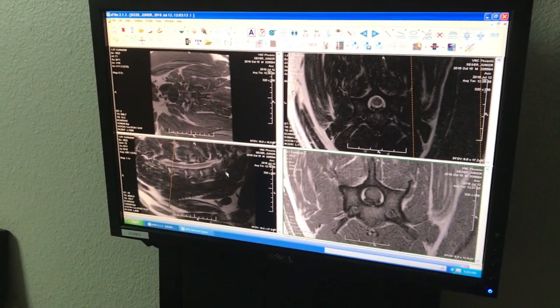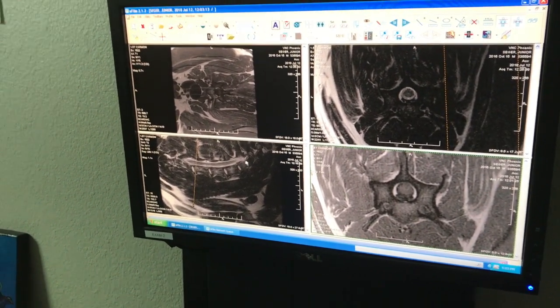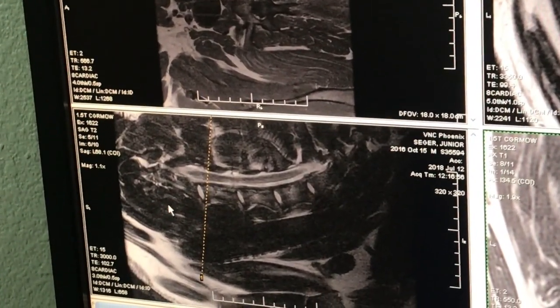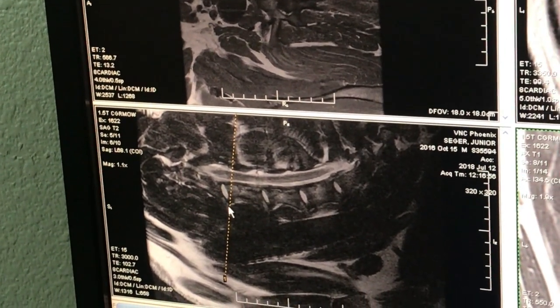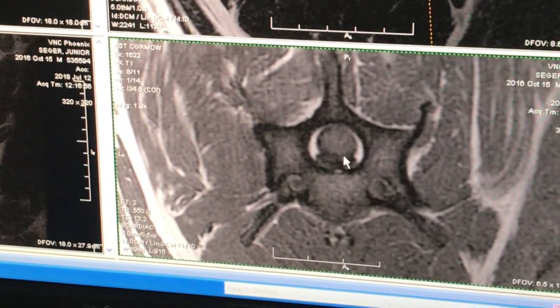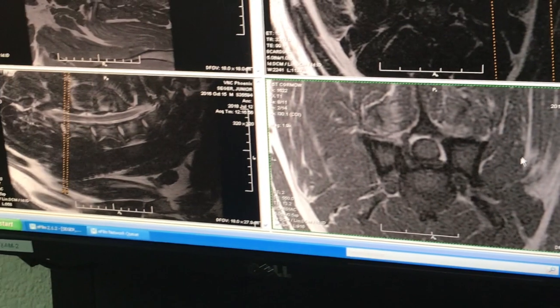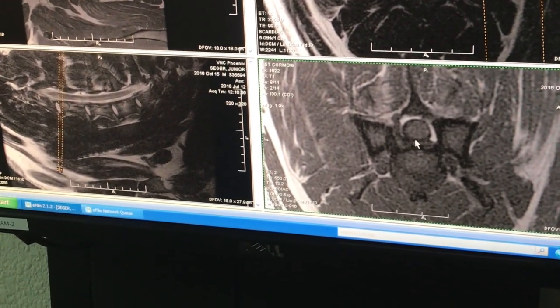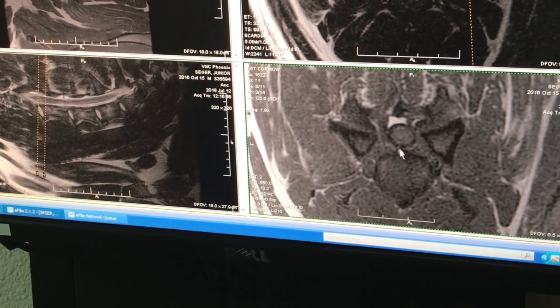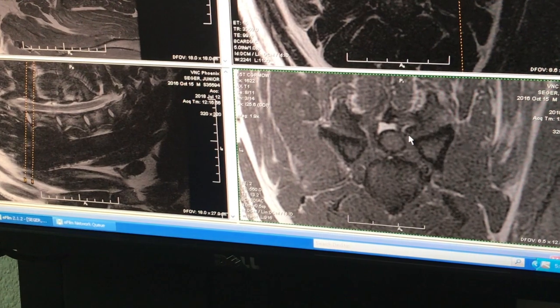Here we have a side view of his neck. Here are the intervertebral discs, here are the vertebrae or bones, and here's his spinal cord coming into view. Right here is the biggest problem area, which is in his mid to lower neck at C4-5. Here behind that is normal in appearance — the spinal cord is nice and round with a nice white CSF or fat column around it. Then as we move forward to the disc space, we start to lose some of that nice column around it.